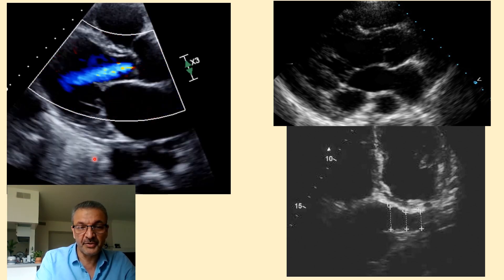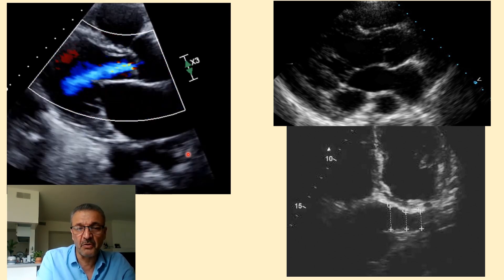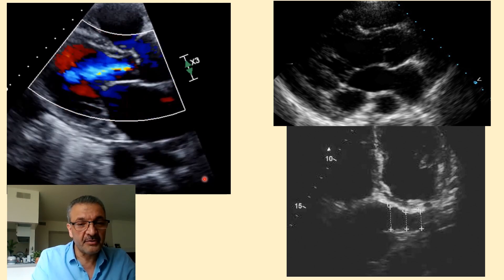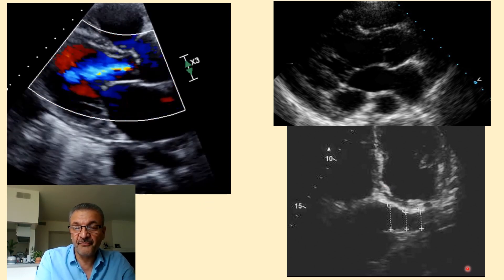Here is the aorta — the thoracic descending aorta in short axis, or if slightly off-axis, a somewhat twisted aorta may appear, or another anechoic structure or fluid. On the parasternal views, we can see the coronary sinus on the RVIT view — apical to the mitral annulus — though not always very clearly. The best spot for visualizing the coronary sinus in long-axis view is the basal four-chamber view.